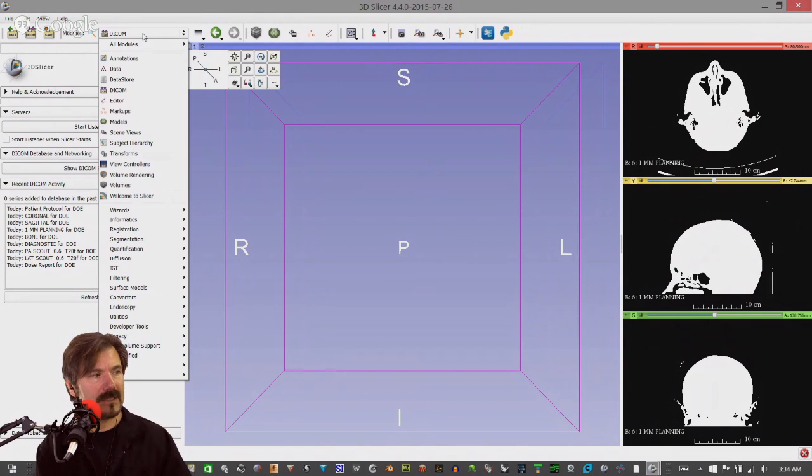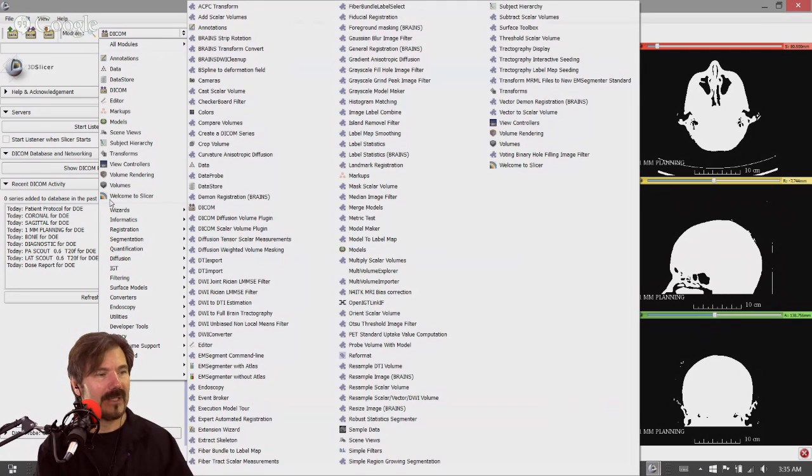In fact, GE just came out a few months ago, I think about 6 months, with something that's almost near real time. So you can literally see the heart pump and things like that because it's able to cycle through the slice operation so quickly. And again, I think it's because of these multiple receptors, because I guess you've got a certain finite period of time that you can fire the electron beam. So they must be doing other tricks on the other end, which is very cool.